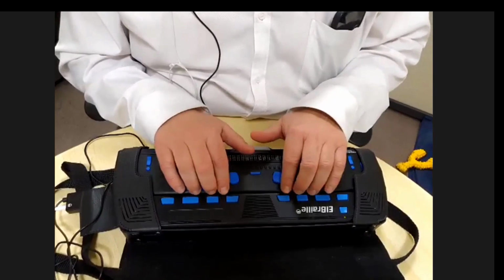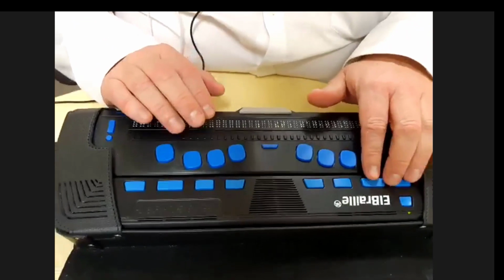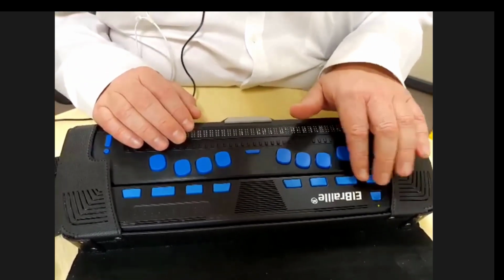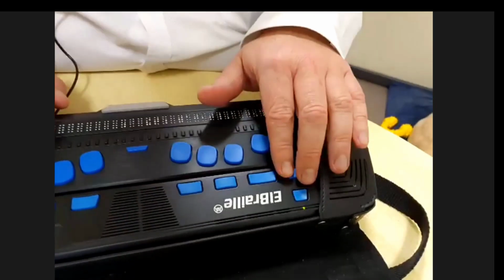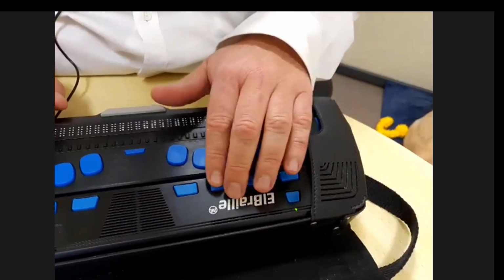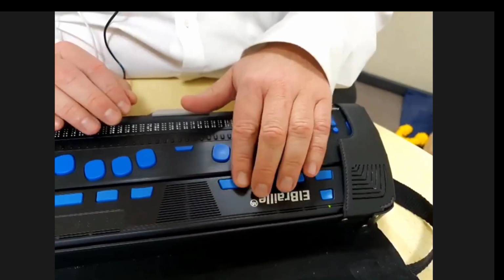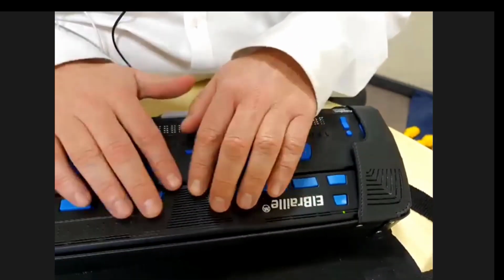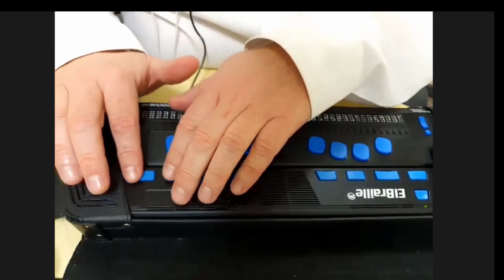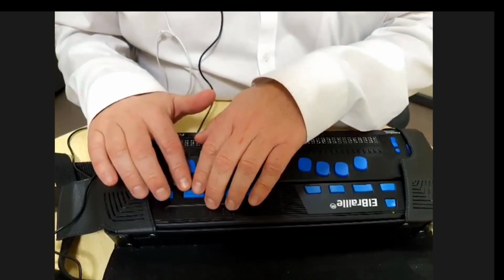Behind that, on the top surface, we have a row of function buttons that can do various things. And I'll talk through that a little bit more in a moment, but we have a volume rocker. We have a menu button that allows us to get into some inbuilt applications that come with the Elbraille. We have a button that gives us battery and network status, and a button that gives us the time and date and those sorts of things. And there's also some of these function buttons that we can program to do particular things or launch particular apps.